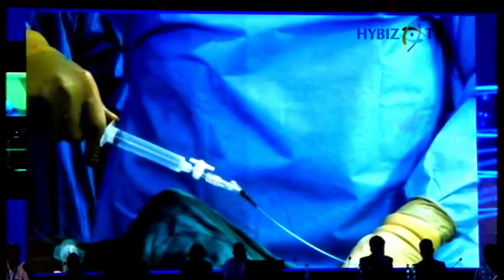Till what time do we have, guys, for transmission? No, we have another 40 minutes. After you prepare this balloon, we will go to the other lab. Perfect. At least you can show us how to prepare the Stingray balloon.